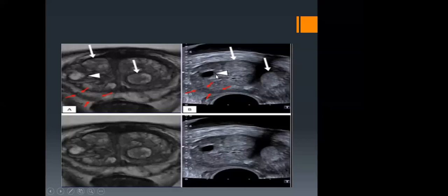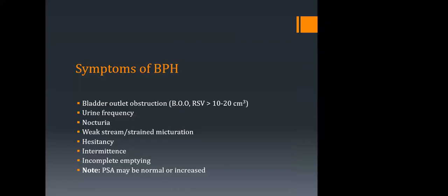But this is where ultrasound was then used. This is a cystic mass and this is a solid mass. Here, this is the cyst, but you can't tell, but ultrasound will show you this cyst. This is a solid mass, and with ultrasound you can clearly delineate that this is a solid mass. But the new modern machines are able to do it.